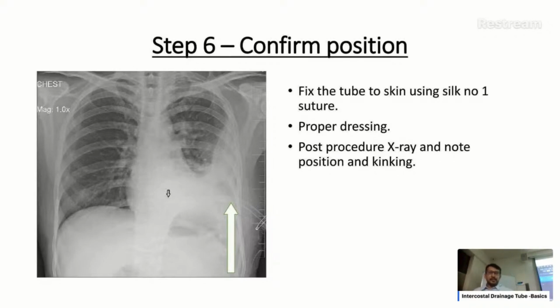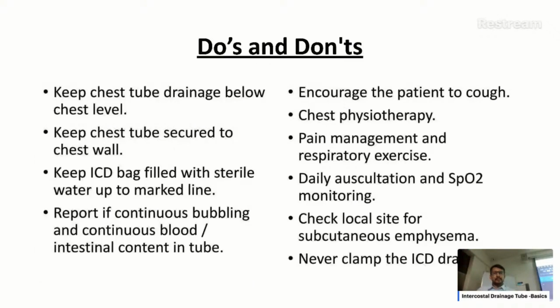Here we can see the placement of the tube. So then the tube is fixed with silk and proper dressing is done, and we have to necessarily take an X-ray post procedure to check the correct positioning of the tube.